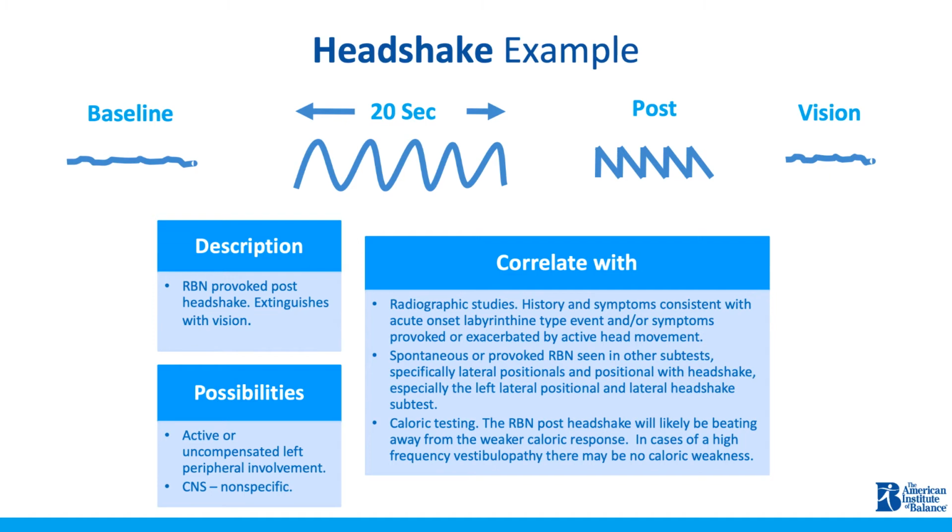Of course, this test should be compared to the patient's history, symptoms, and results from other tests in the battery. One thing to consider is where this test should fall within the patient's appointment and testing battery. As you can see, this is a symptom-provoking test, and those with unilateral vestibular dysfunction will often feel nauseous during and after. So it's important to not start with the high-frequency headshake. If the patient becomes ill right at the start of the appointment, they may not want to continue for a significant period of time, or, in extreme cases, some may not want to continue with testing at all.